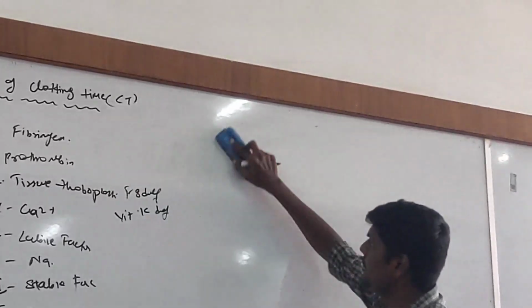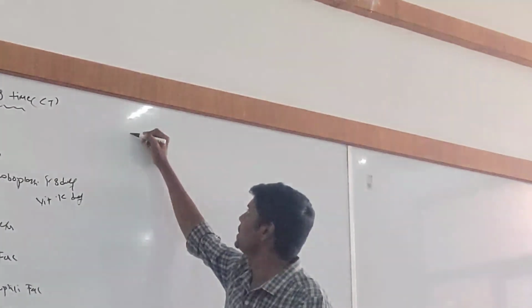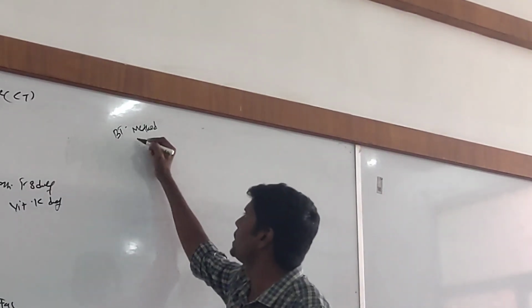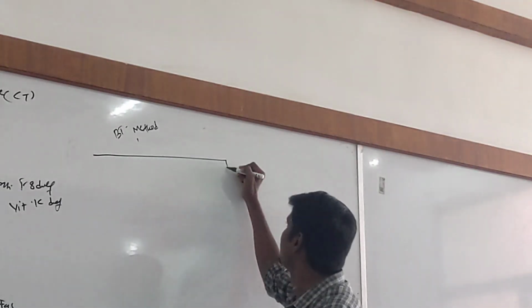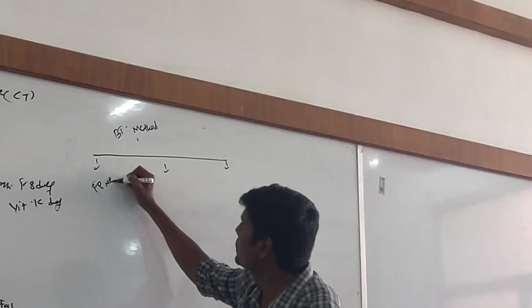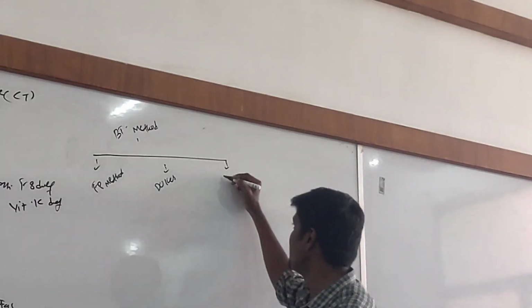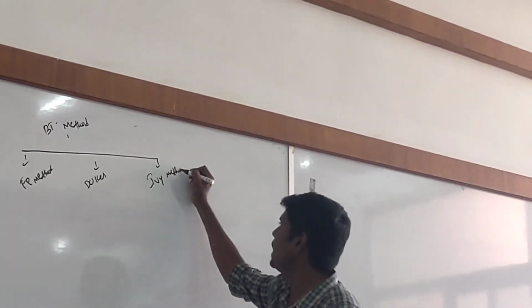Shall I also add this one? Methods of bleeding time estimation, tell me students. Bleeding time estimation methods, lab test methods. Tell me the three methods. Yeah, very good. We have the finger prick method, Duke's method, very good, and the IVY method. Yeah, very good.